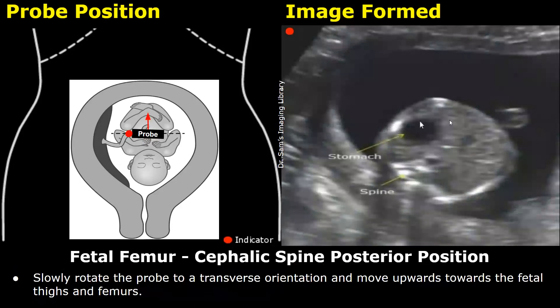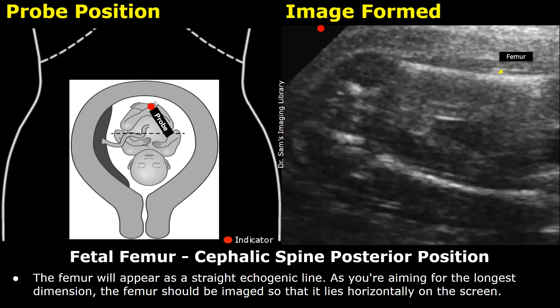Slowly rotate the probe to a transverse orientation and move upwards slowly. This image is at the level of the stomach, so keep moving upwards, which will lead you towards the fetal legs. When you start to see the fetal legs, try to locate the thigh — that is the femur — and rotate and angle the probe accordingly. You should get an image showing the femurs and the pelvis. The femur will appear as a straight echogenic line.